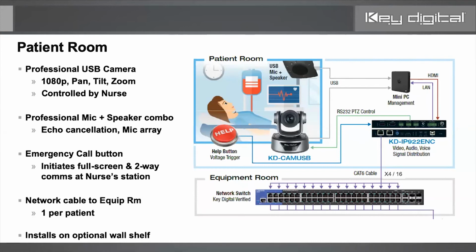Thank you, Jonathan. Yeah, I believe that's a common misconception on the IP922, since it has a USB input. Correct me if I'm wrong, Jonathan. I think the bandwidth limitation on it is limited to 512 kilobits per second, if I'm not mistaken. Something in that range. I'm not sure. You may be right about that, Leon. But basically, it was designed for KVM basic data applications. So that's something to keep in mind.